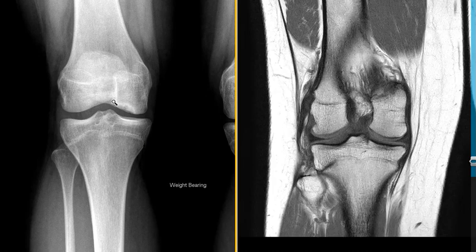This is the lateral femoral condyle — the outside of the femur. The femur coming down, the lateral articular surface looks nice, homogeneous, sharply defined margins. But the medial side has an area that is too dense and irregular along the articular surface, so this is an osteochondral defect.